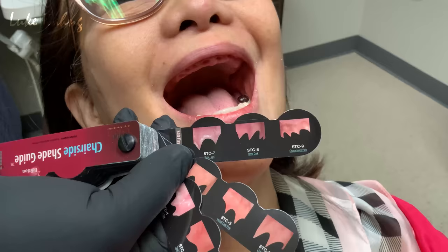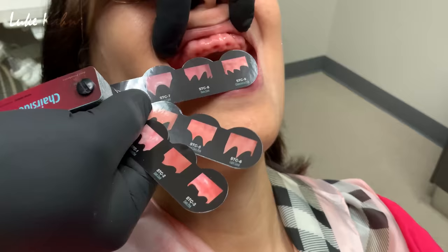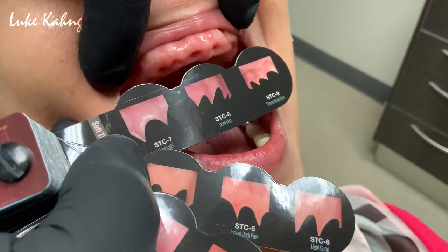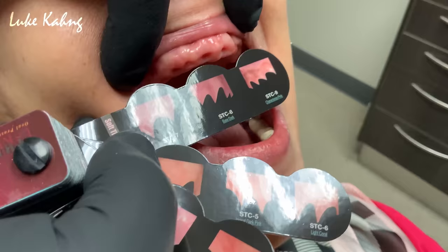And I'll go through and very carefully, open big, go through each one of these. Can you see that there? And compare them. And I'll take pictures. If it's in between two of them, I'll take pictures of both. And then I'll send that in with my case. I email my case, and when I get it back, I get beautiful, beautiful dentures. Try this. See?